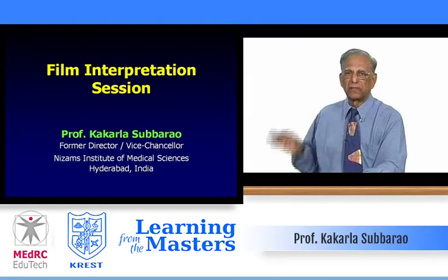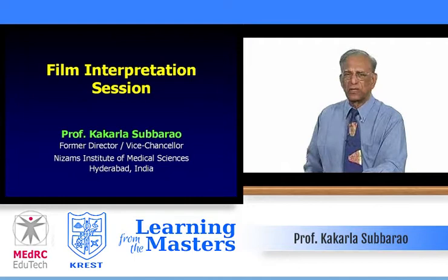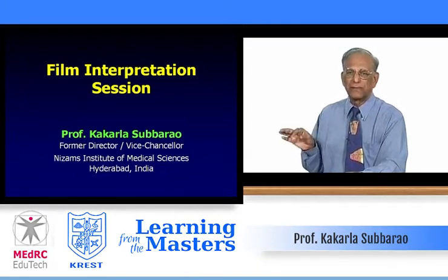This is a film interpretation session. Film interpretation session was started in the USA, the United States of America, and then several nations are following, several state and national radiological societies are also following. Actually, film interpretation session is not a quiz.